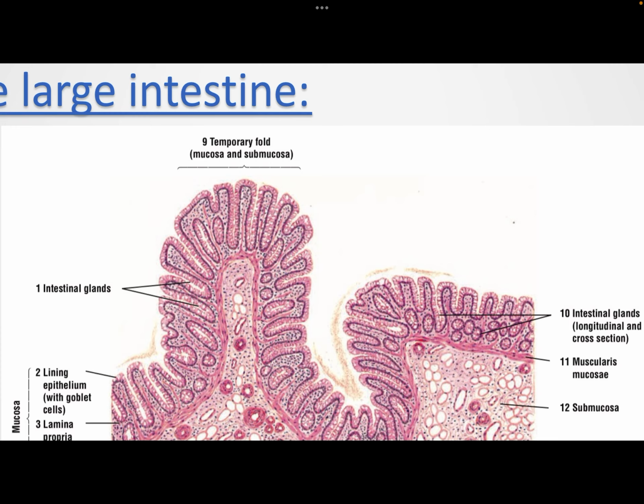You guys know that this is a GIT. Somewhere in the GIT, I'm in the alimentary canal. But to differentiate between stomach, small intestine, and large intestine, this is how you need to think at this point. After listening to all my videos, now you know the general organization, you know the structure. This is how you differentiate between them after knowing all the information.